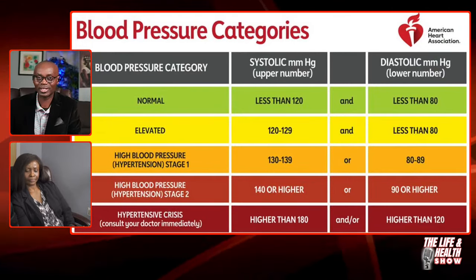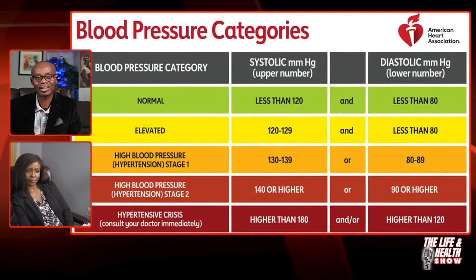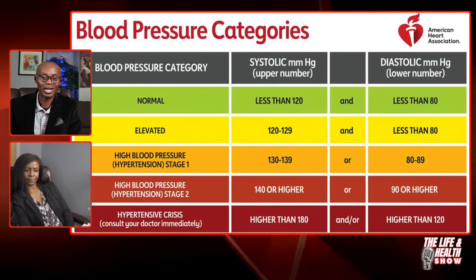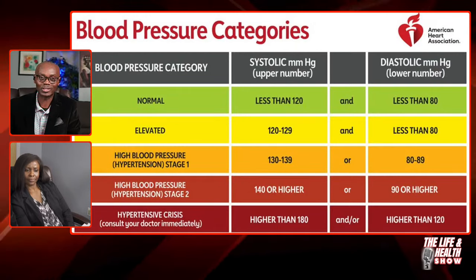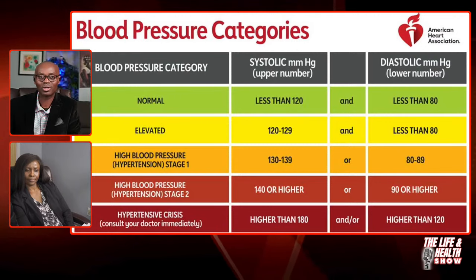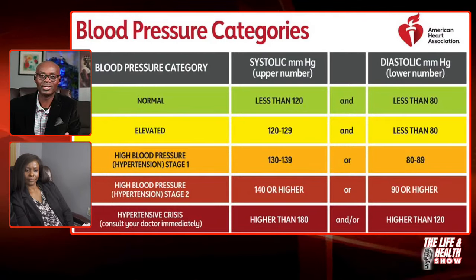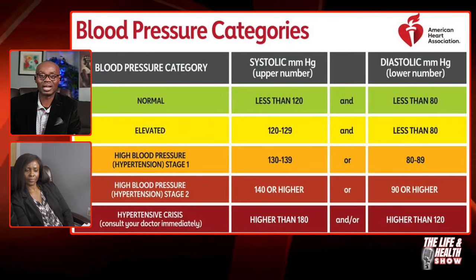If you can call your doctor and you want to just see, you can tell right from this chart that your blood pressure may be elevated. It may be normal. It may be in stage one. It may be stage two. And you may be in crisis, in which case, we explained that you have to see or call your doctor immediately, because you will be a walking stroke waiting to happen, a walking heart attack, walking aneurysm waiting to happen, gone too soon waiting to happen, which we don't want to hear. And so this will be a guide to you.